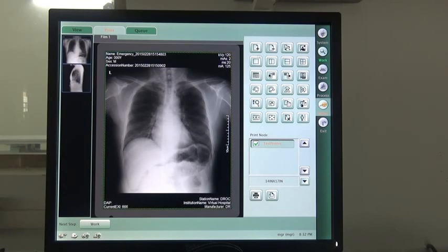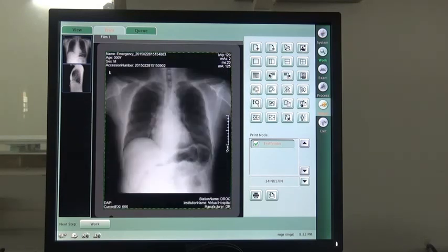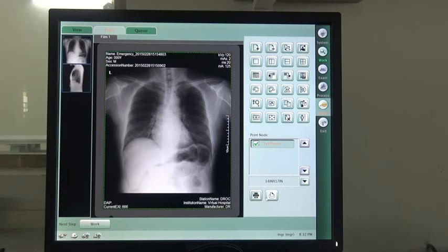Here is the print function. It supports both DICOM print and Windows print. Also, before printing, you can adjust the image layout as you want. That's all for this system's introduction. Thanks for listening.